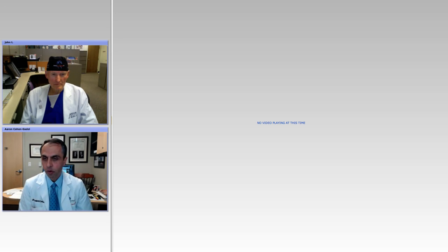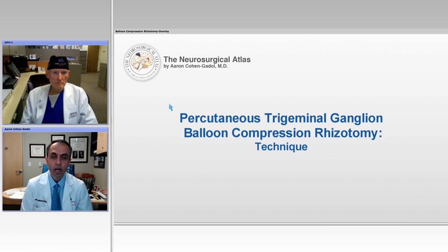So let's go ahead and review this video. I want to make a differentiation that the balloon compresses the Gasserian ganglion, so it's at the level of the ganglion, while radiofrequency rhizotomy is at the level of the roots of the trigeminal nerve. There is a big difference between the two. So if you put your needle over radiofrequency and you're not exactly at the level of the root and you're more distal, you may actually get an exaggerated pain response, and it tells you that your needle is not at the right position.